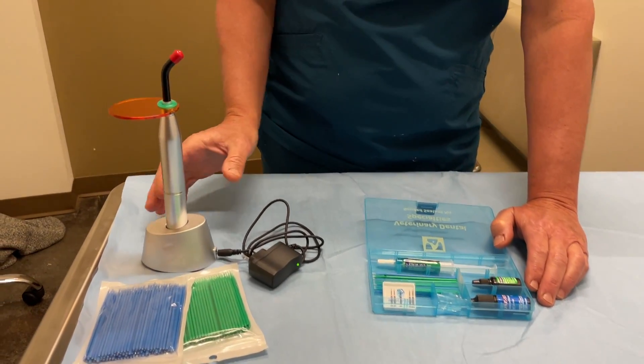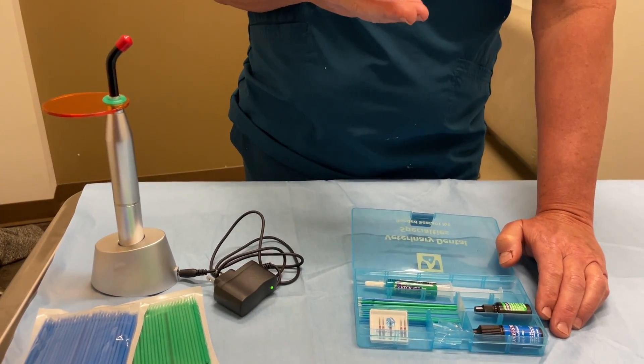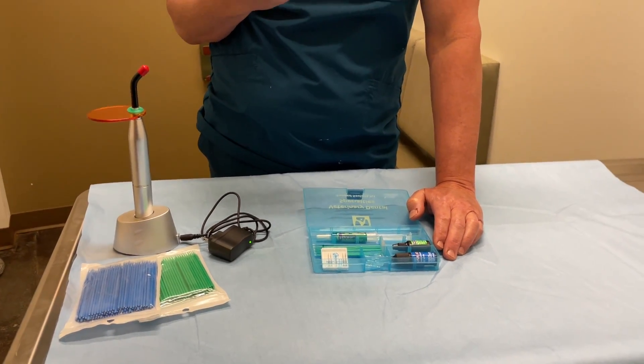And then obviously the light curing gun that goes along with it. All of this comes in the bonded sealant kit. Like I said, it should treat somewhere between 35 and 40 teeth. And it works really, really well — it's super quick. So I strongly recommend it on almost every patient.